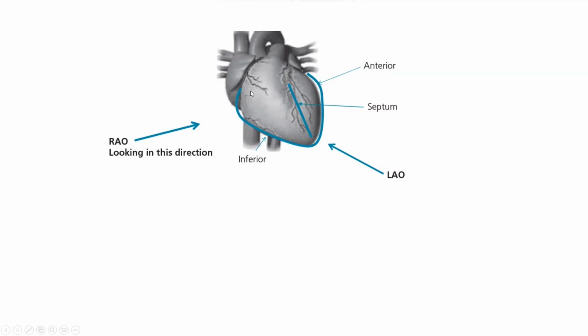RAO view looks in the AV groove and spreads apart posterior from anterior, specifically in the fistula case, to spread apart atria, particularly RA, from RV. So you do image the fistula in two views to define its landing, where it's terminating, okay?